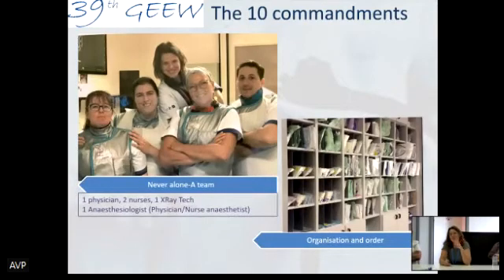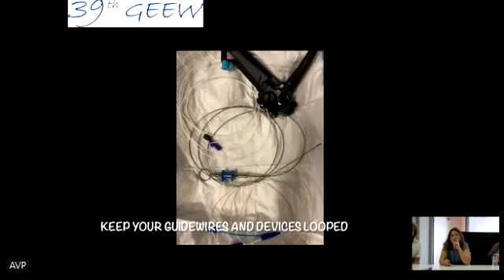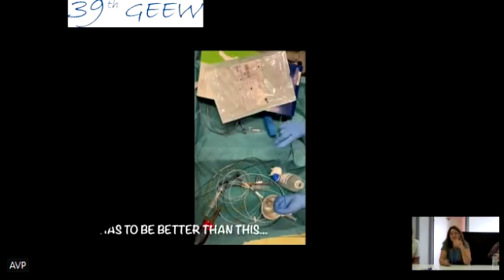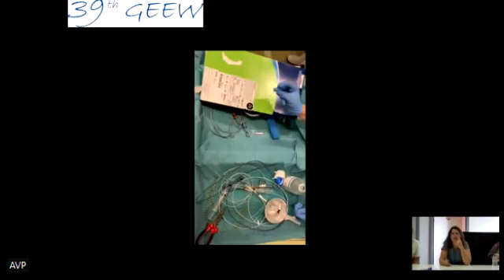Organization, order in the room, to know where everything is. I have a labeling. I think we have a little video for that. Organizing your environment. Labeling can help keep things in the same place and know what you're looking for. You can use little tricks to label your guide wires. You keep them looped to have a little bit of visibility, because when your working table is like this, it's a bit difficult, so we have to get better.